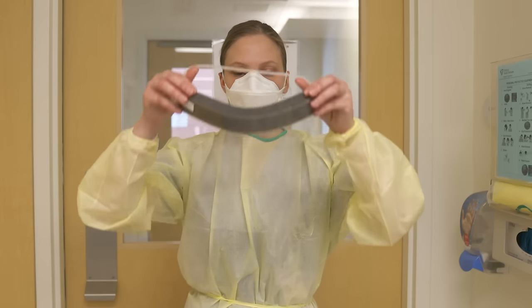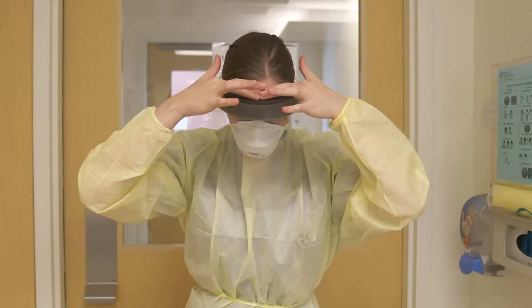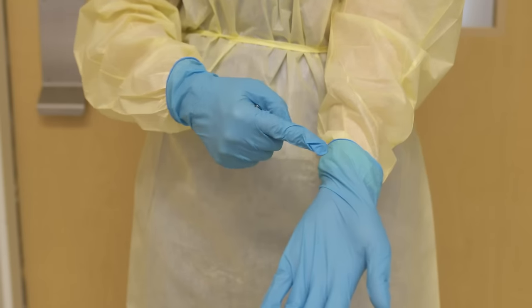Don face shields by placing the strap at the back of the head, ensuring the shield is resting in the middle of your forehead. Put on gloves one at a time, making sure they are snug over your gown and no skin is exposed.